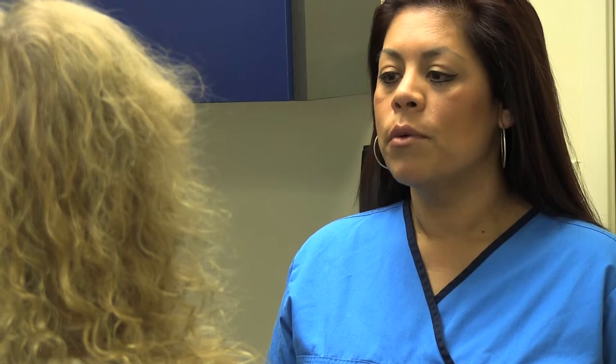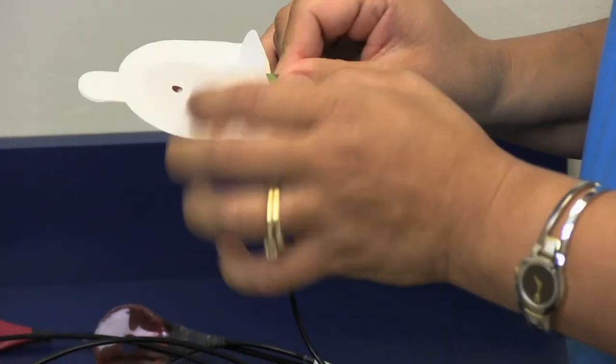To remove the equipment at the end of the test, do the following: disconnect the sensor array from the data recorder, take off the recorder belt with the data recorder, and keep it in a safe place. Remove the sensor array from your abdomen by peeling off each adhesive sleeve, starting with the non-adhesive tab and leaving the sensor inside the sleeve. Do not pull the sensor array wires or leads, and do not remove the sensors from the paper adhesive sleeves. Place the sensor array with the rest of the equipment and return all equipment to our office as soon as possible. Handle the recorder and other equipment carefully without exposing them to shock, vibration, or direct sunlight. You are responsible for the equipment during the time of your exam. If you are not sure the capsule has passed or you develop unexplained nausea, abdominal pain, or vomiting, contact us immediately for an evaluation. The doctor will be in shortly to answer any questions.